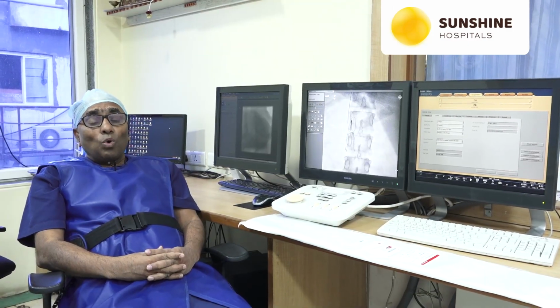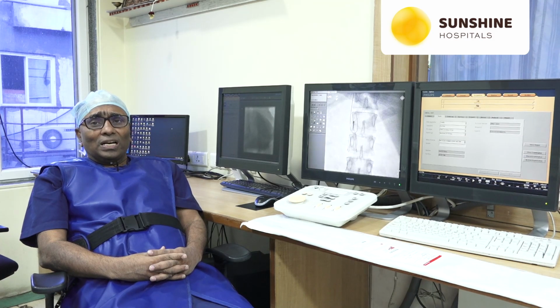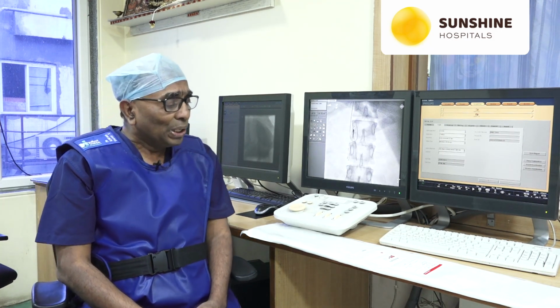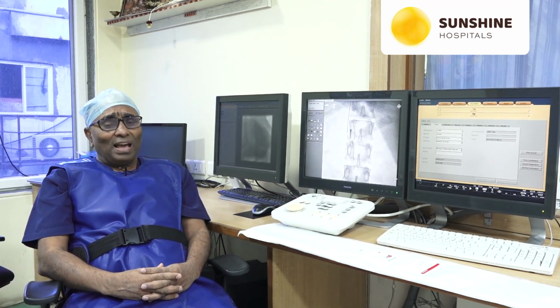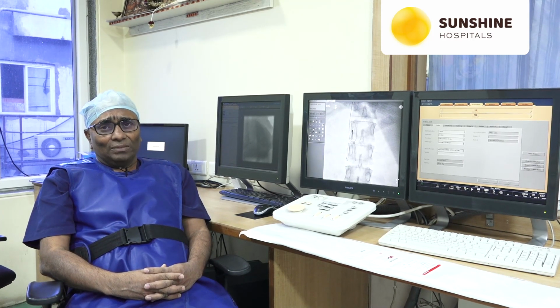We snare the hook of the IVC filter, and afterwards we push the sheath to encroach the IVC filter. Then the filter is removed entirely with the sheath. This is the technique of IVC filter retrieval. Usually we use the Gunther Tulip IVC retrieval filter, which is manufactured by Cook company. It is a safe technique.